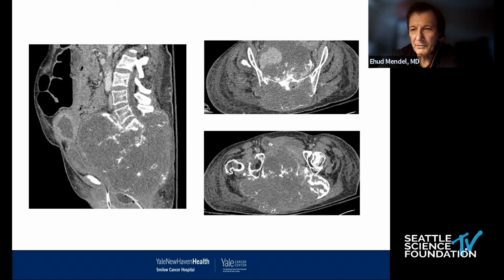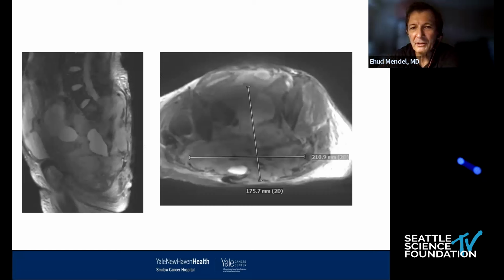What do you do for this? The patient is in the hospital on a massive amount of pain medication, and this has now become, from an en bloc option, not really; there are no good en bloc options here to resect something like that. You can see the MRI right here. The canal is full, the pelvis is full of tumor.